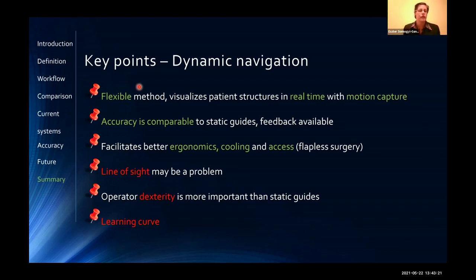And there is definitely a learning curve. It's a paradigm shift. One has to be able to translate computer screen movements to hand movements. And it's not enough that you translate it, but as soon as you move from the maxilla to the mandible, all the movements shift around. So it's not as simple as it sounds, but it's definitely learnable and doable.